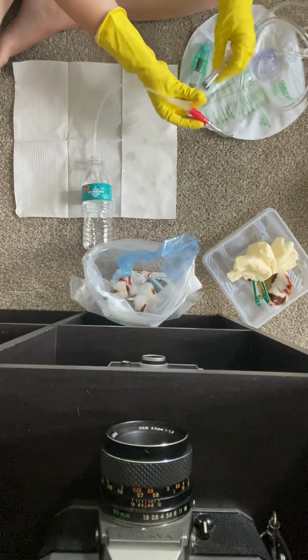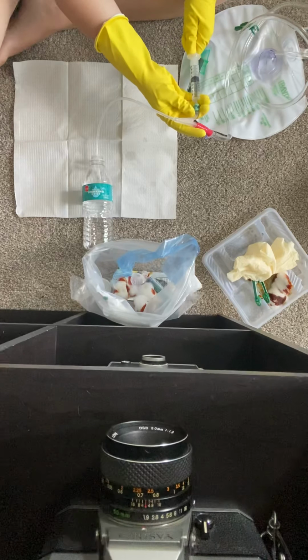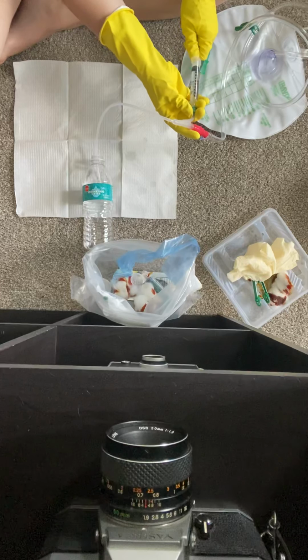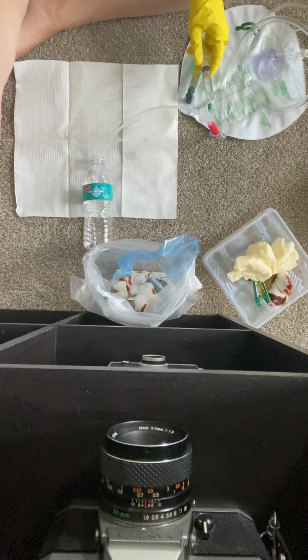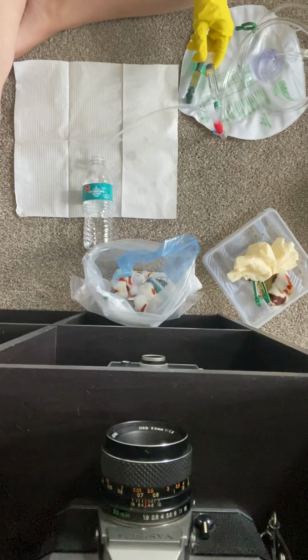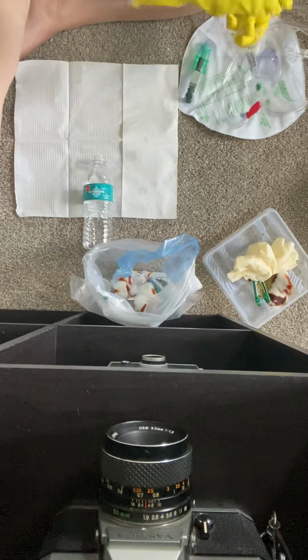So what I am going to do is attach the syringe to the port here that I blew up the balloon with. And then I'm gonna pull back the plunger here, and I instilled 10 mils. So I wanna make sure that I get the full 10 mils out, or as much as I possibly can, because you don't wanna pull that out when the balloon is still inflated. I usually have my patient take a deep breath for me, and when they breathe in and start to exhale, I would take the catheter and pull it right out, and I just kind of loop it up like this.